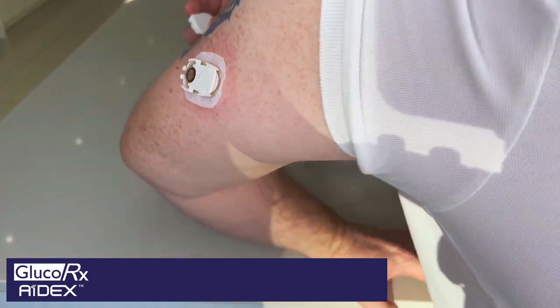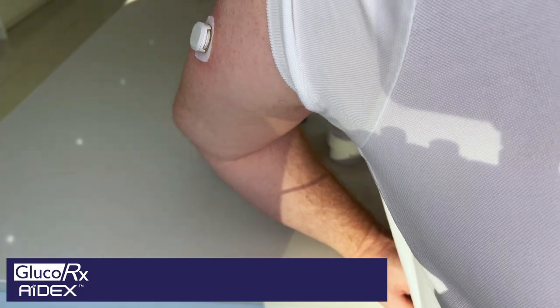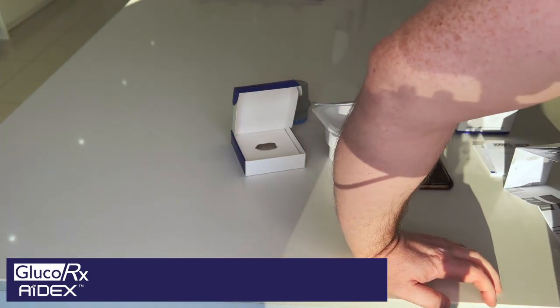Now with the transmitter, you apply the transmitter just by clicking and pushing it into place. Once that's pushed into place, that is then everything ready to go.